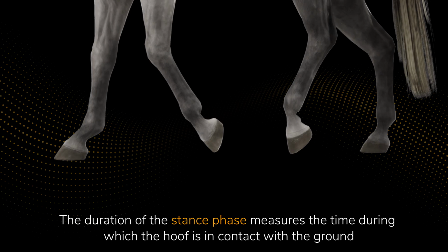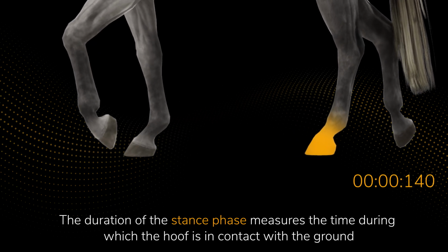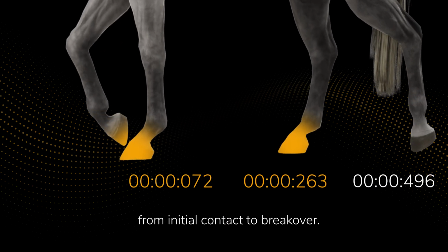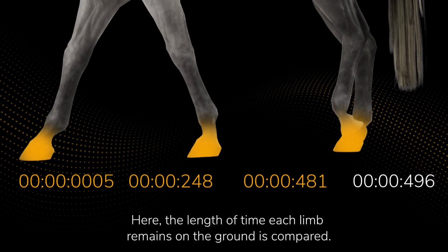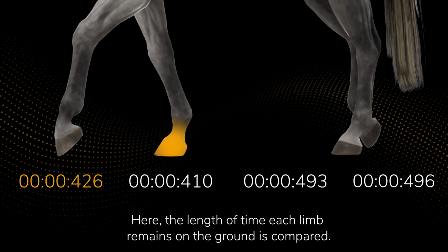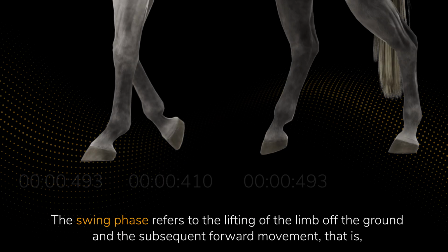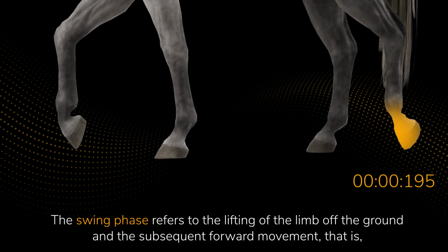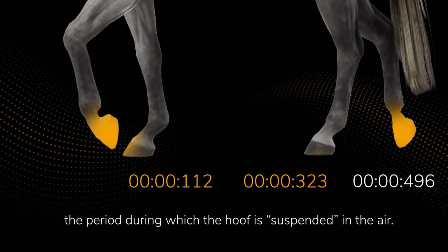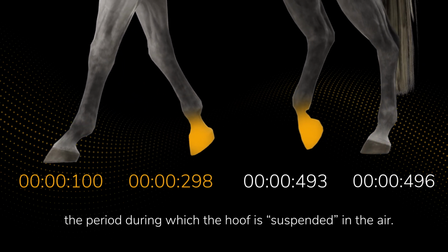The duration of the stance phase measures the time during which the hoof is in contact with the ground, from initial contact to breakover. Here, the length of time each limb remains on the ground is compared. The swing phase refers to the lifting of the limb off the ground and the subsequent forward movement, that is, the period during which the hoof is suspended in the air.